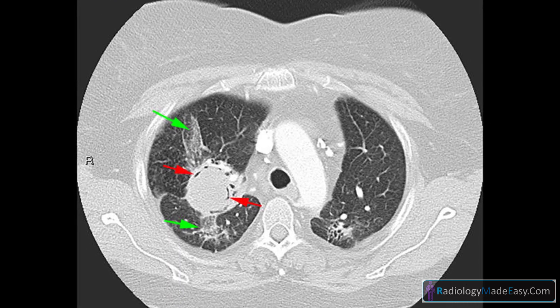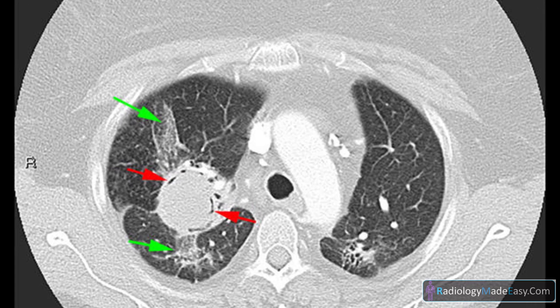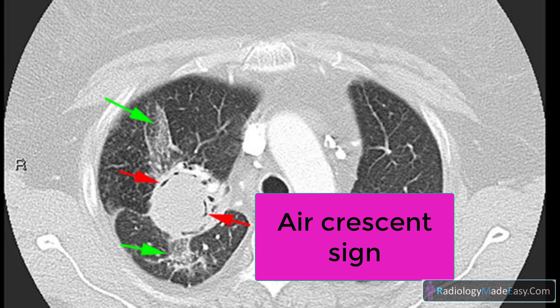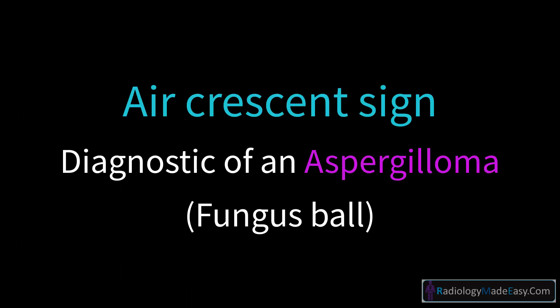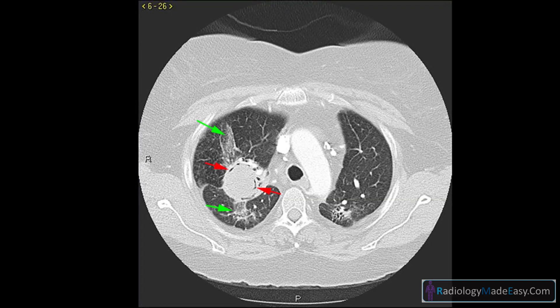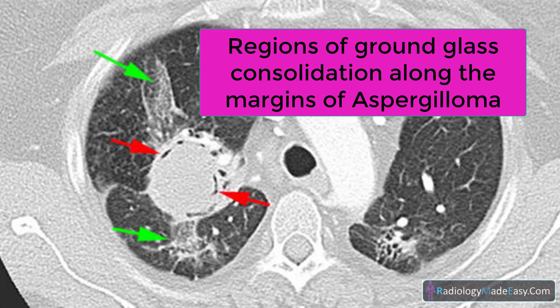The red arrows demonstrate lucency representing air along the margins of the lesion, which is known as the air crescent sign. This sign is diagnostic of an aspergilloma, also known as a fungus ball. This consolidation represents a collection of the fungus Aspergillus within a pre-existing lung cavity. The green arrows indicate regions of ground glass consolidation along the margins of the aspergilloma.